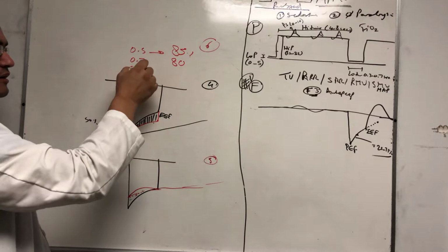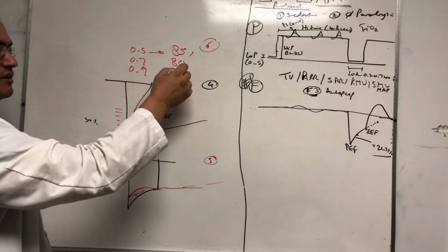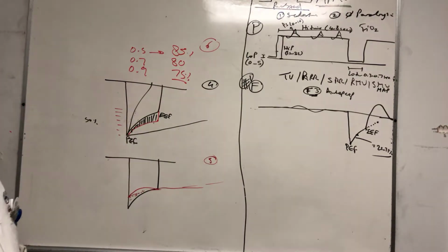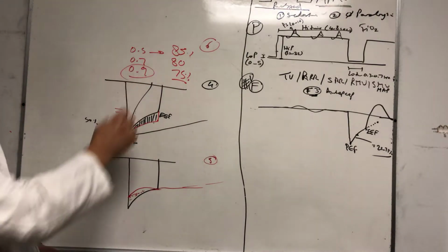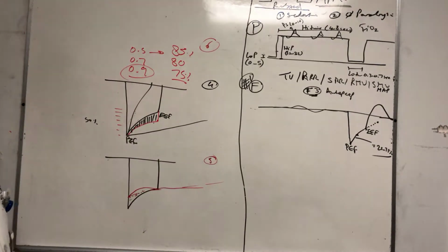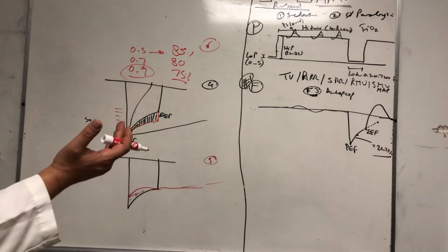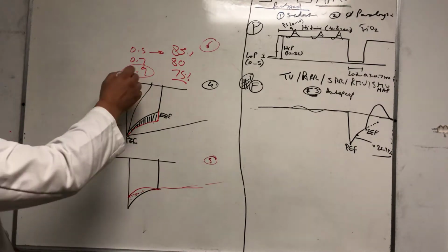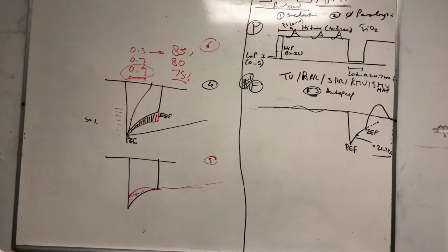Prolong it to 0.9, still reading 75%, for example, or 74%, that's too high, right? Once you start to go to 0.9 seconds here, then you say, this mode is not the mode for this patient. I can use the same mode but switch it to bi-level as opposed to classic APRV, because he's not tolerating the short exhalation time.